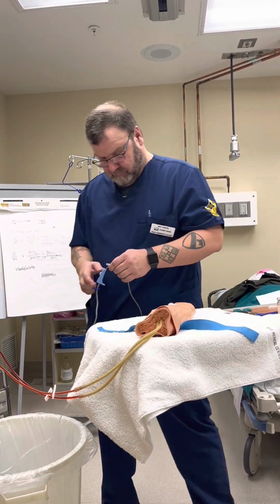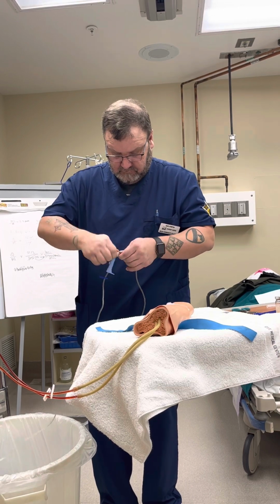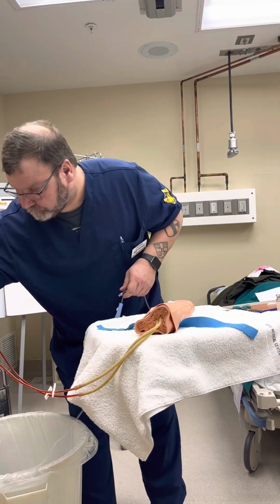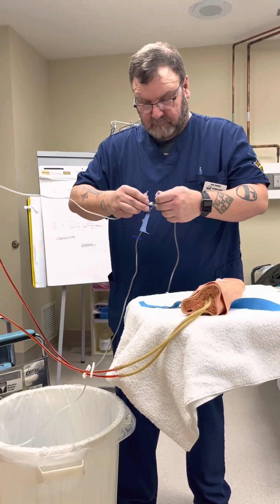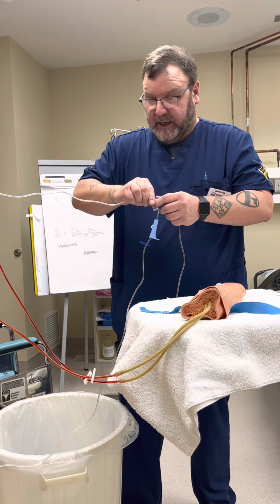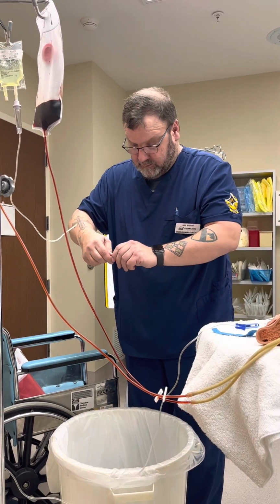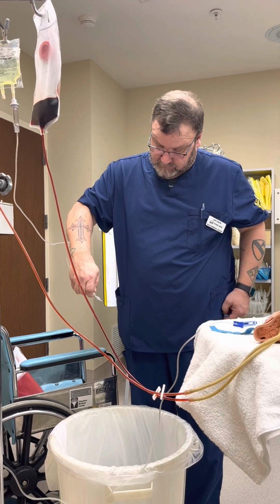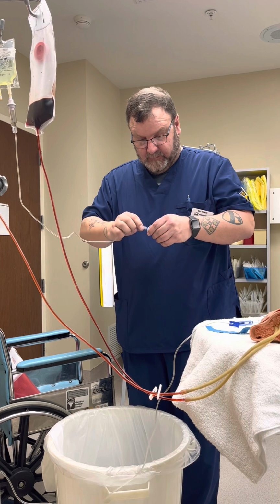That's two of them. And Dave's going to prime his line. Oh, first. Yeah. Very good. Would have figured that out. So, get all the air out. There we go.